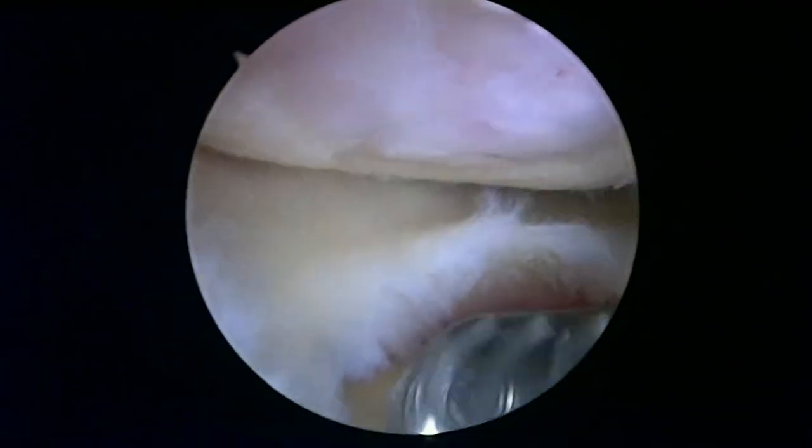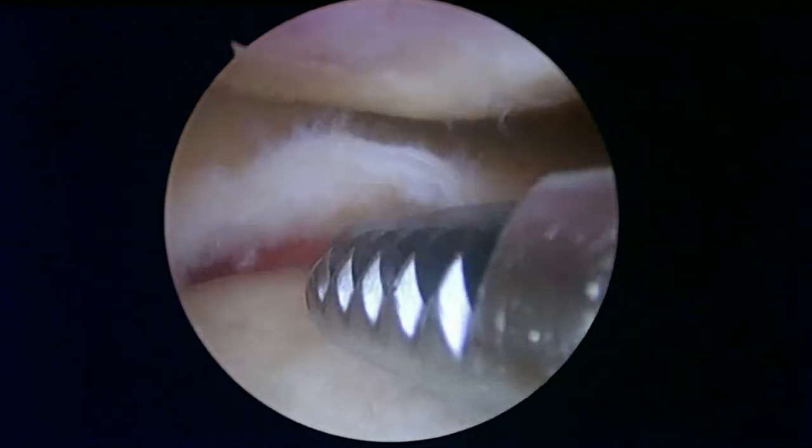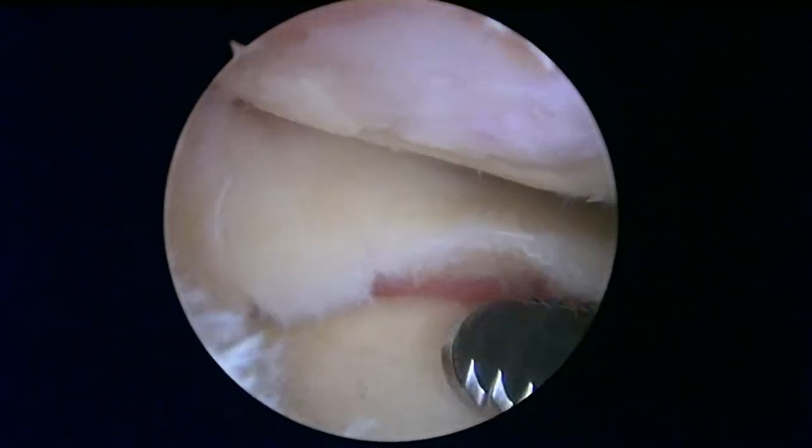As we start to get a better picture in the lateral compartment, we can see this is where there's even more arthritis than on the medial side. You're essentially missing all the cartilage from a large portion of the femoral condyle up above. There's also some very degenerative meniscal tearing going on here — it's very vascular, so we're going slowly trying to control the bleeding. This cartilage at the margins is not very stable, so we'll do our best.